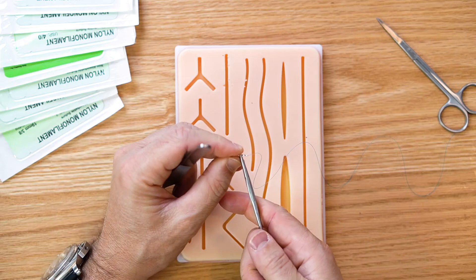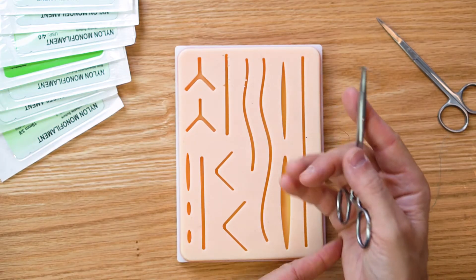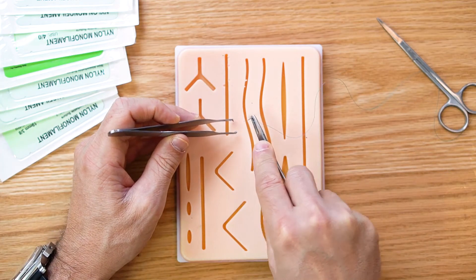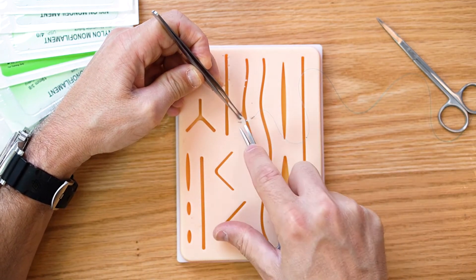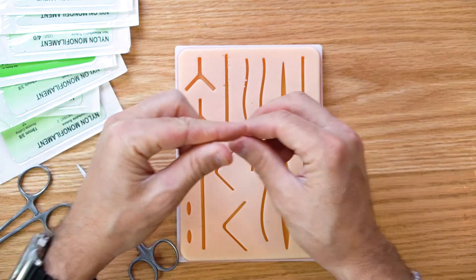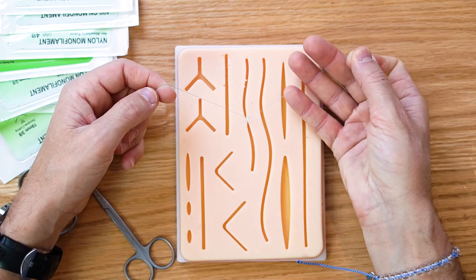Now we're going to go to the one-hander. I'm going to take this out. A little practice here — the tip of the needle driver, my finger goes down close to the tip to keep it steady. My elbow is on the table, my wrist is on the table, my hand is on the table, my pinky's on the table if I have to, to keep it all steady. That's as steady as you can get it. Go across there, turn my wrist, let go. If I need to hold this, I hold the tissue, not the needle, pull it out. Now we're going to do this: the one-handed. I'm going to do a right-handed one-handed first because this is the one I do all the time. Hold the suture like this, same as before.